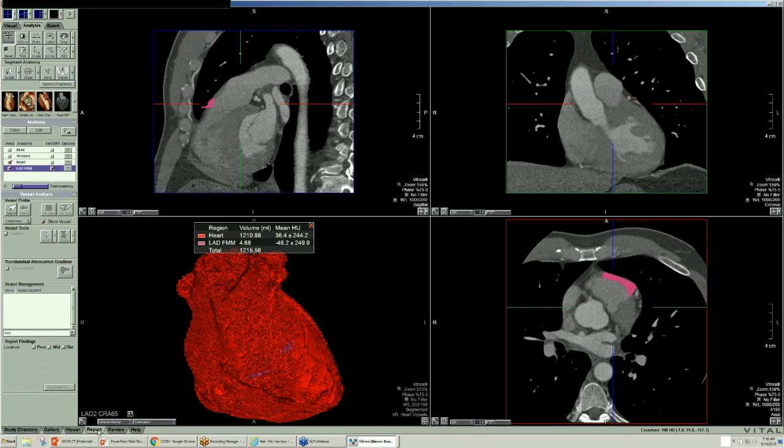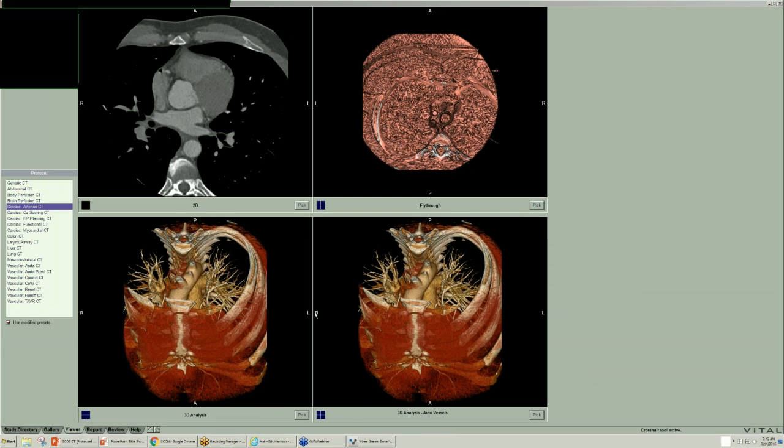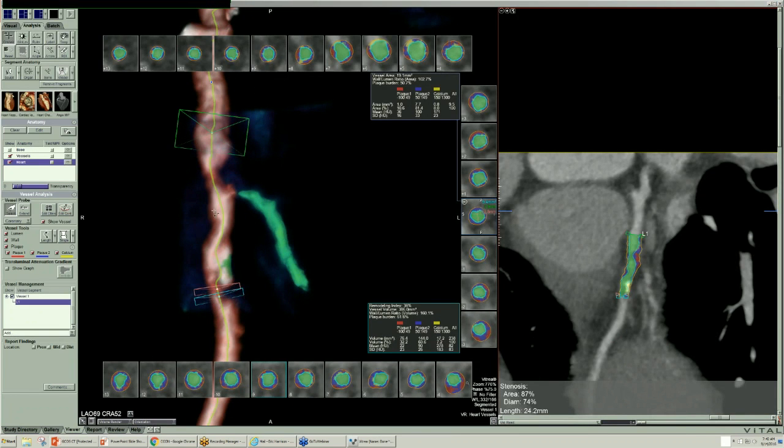Let's go back over here, and I can show you just a little bit more of what we can do that's kind of interesting in terms of defining the vessel hemodynamics. And here's a vessel, and here we're working on calculating angles. And I can show you what this angle is because we can touch down on it. And so we touch down here, we touch down here, and we touch down here. And we got the angle of convergence. Actually, we would subtract this from 180.